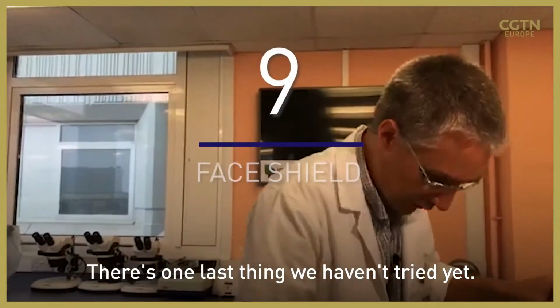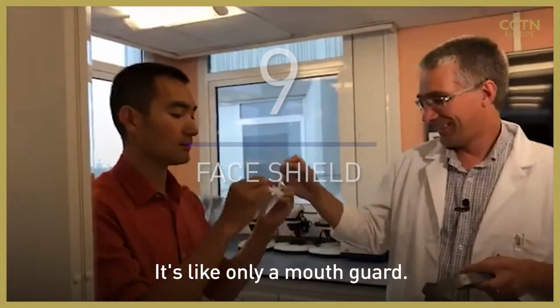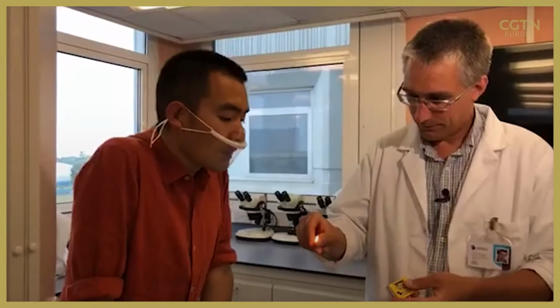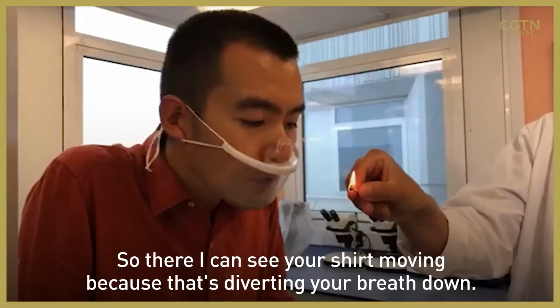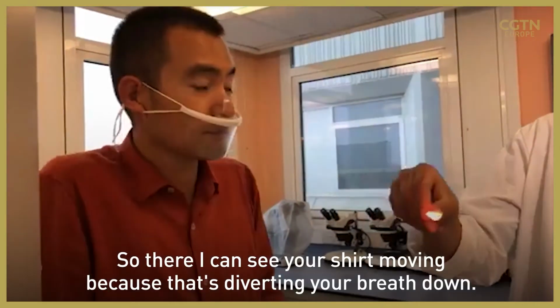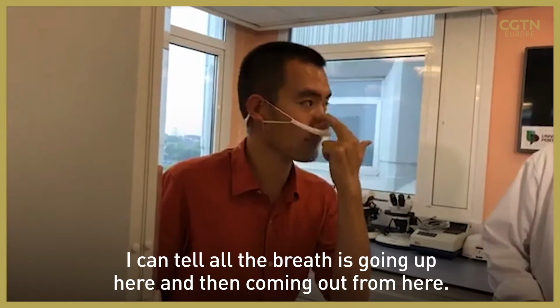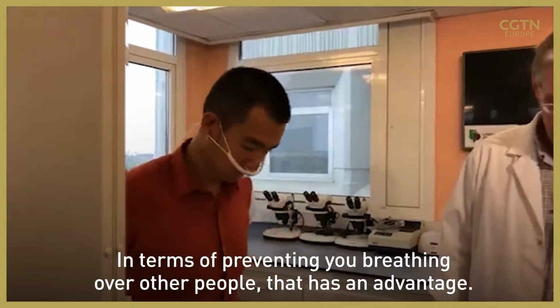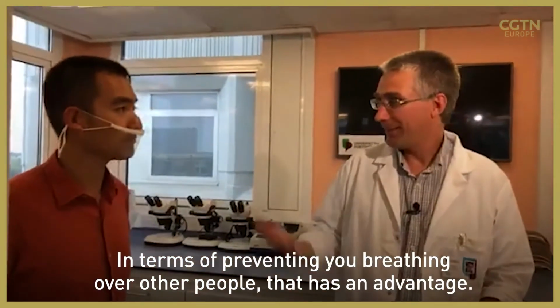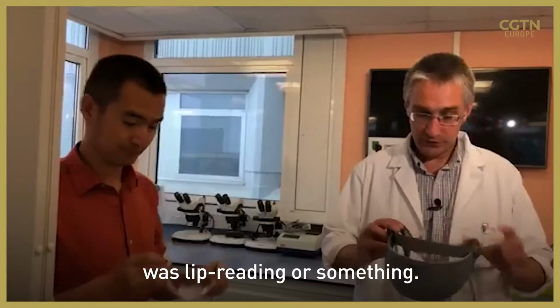Okay, so then there's one last thing we haven't tried yet. It's like only a mouth part. So there, and in fact I can see your shirt moving because it's diverting your breath down. I can tell all the breath is going up here and then coming out from here. So in terms of preventing you breathing over other people, that has an advantage, and I can see your mouth as well. That's helpful if someone was lip reading or something.